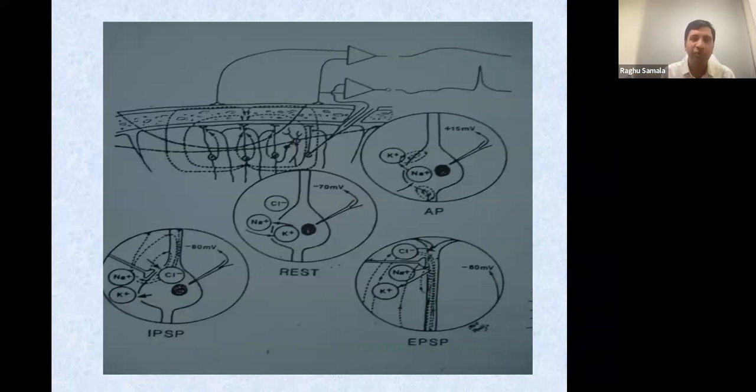And all of us know that when you want to record something, it is always the difference between two points. When we talk about the current, what is the first word I used? We are trying to record the electrical activity from the brain. Electrical activity comes with a potential difference between two points. So what you are going to record is the potential difference between two points.